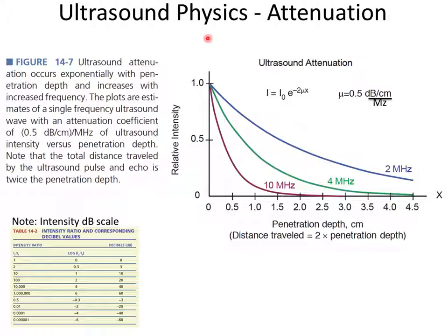Hence, that signal-to-noise drop, as we saw as we moved through the object. Right up at the top near the transducer, we had really pretty images of the surface, and then as we went down, it got a little noisier. Okay. So this comes into play also in selecting the frequency at which you're going to make an ultrasound picture. Because if we move our transducer to 4 megahertz, we will see objects that are deeper, right? Relatively speaking, to the 10 megahertz.